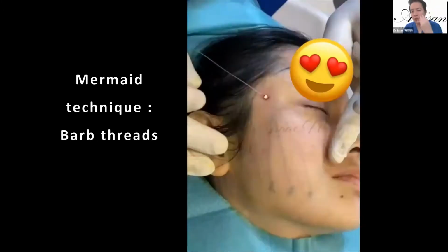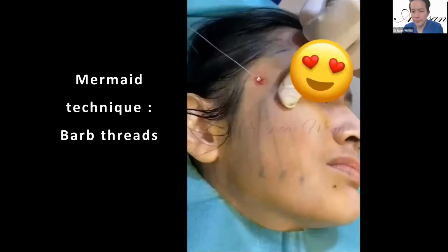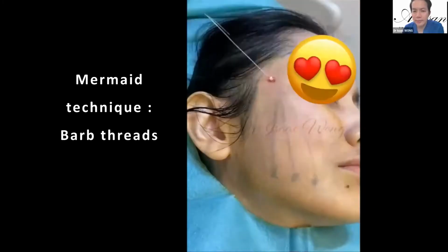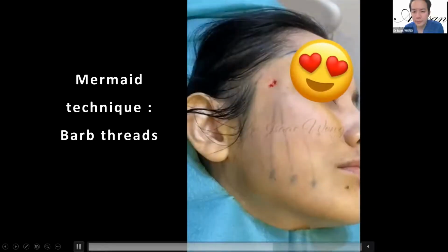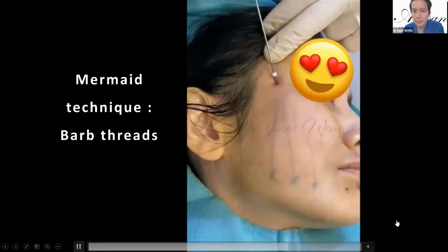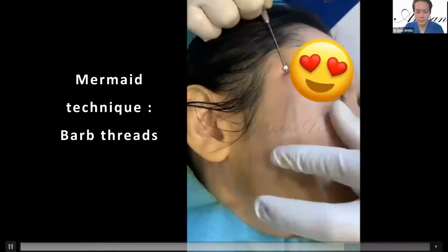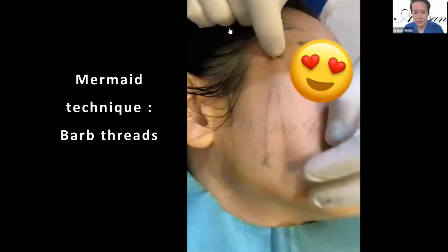Make sure the tissues are all bunched up onto your hooks, and that way you get an immediate lift. You can see the nasolabial area is totally lifted now. Okay, next to the jaws.